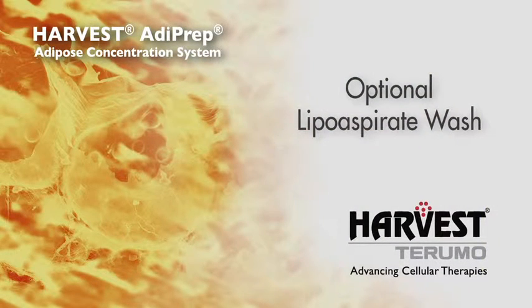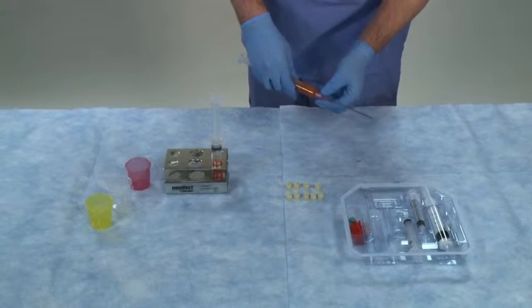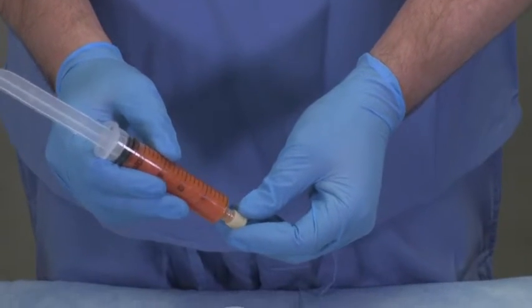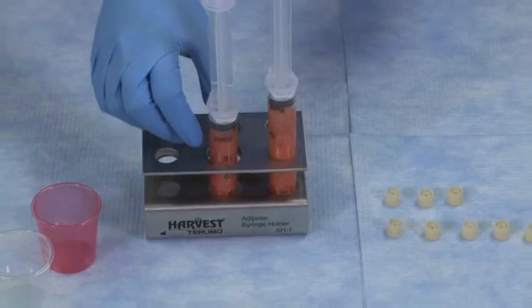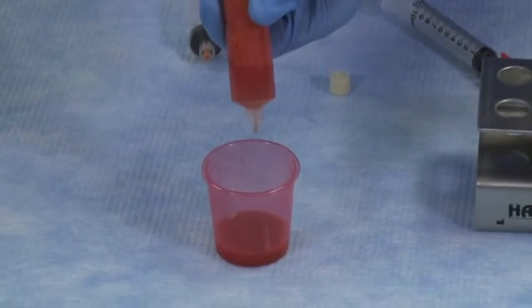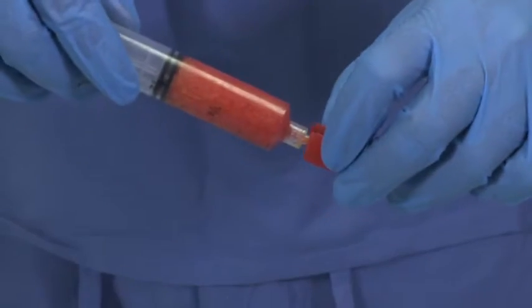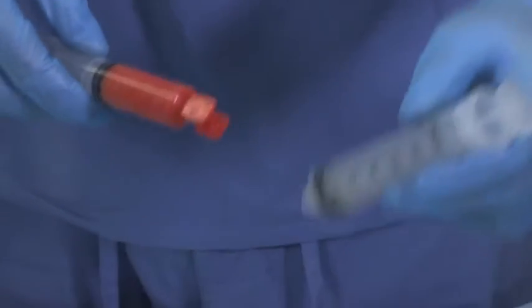An optional wash may be performed in cases where lipoaspirate samples contain significant blood content. This step will help further purify the adipose sample by removing red blood cells and other blood components. After filling collection syringes with lipoaspirate, replace the cannula with a tip cap on the end of each syringe. With the tip cap facing down, place each syringe vertically into a decant rack. Allow the lipoaspirate to stand for at least one minute. The infranatant fluid will settle to the bottom of the syringe. Expel the separated infranatant fluid out of each collection syringe into disposable cups.